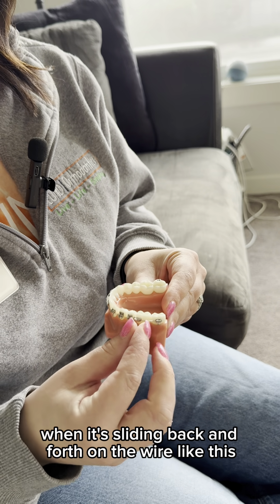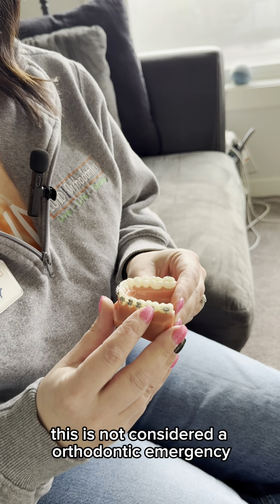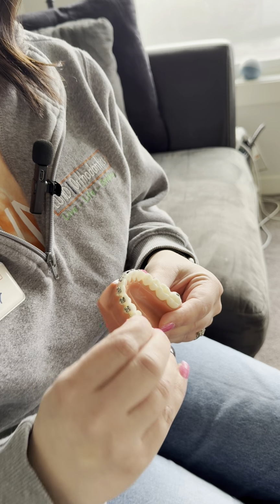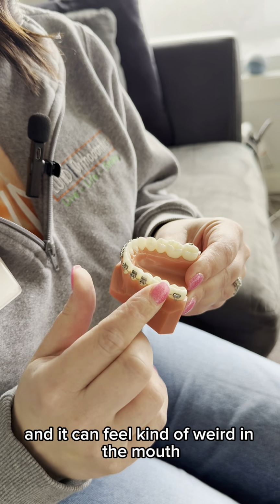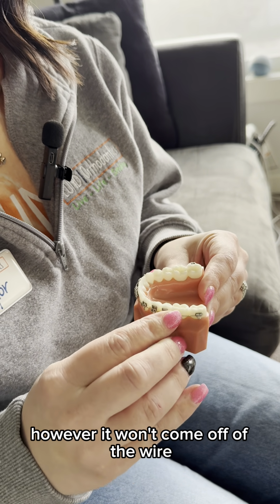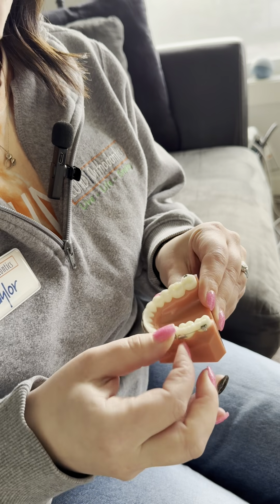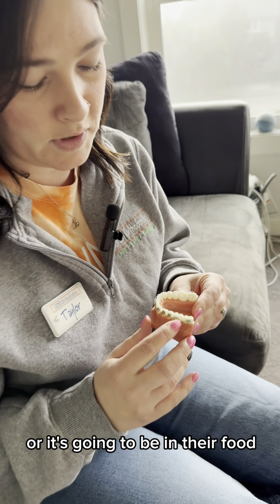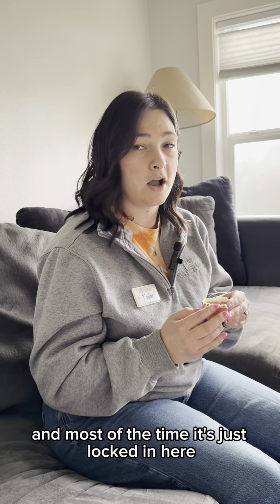When it's sliding back and forth on the wire like this, it is not considered an orthodontic emergency. It is a little uncomfortable sometimes because the bracket can twist and it can feel kind of weird in the mouth. It also can just be really annoying. However, it won't come off of the wire because it's locked in here by two additional brackets. People oftentimes are concerned that their kiddo is going to swallow it or it's going to be in their food. And most of the time, it's just locked in here.